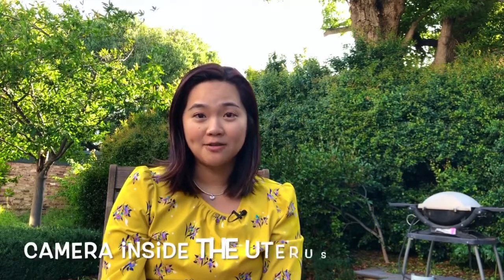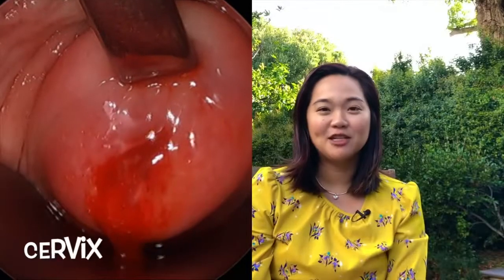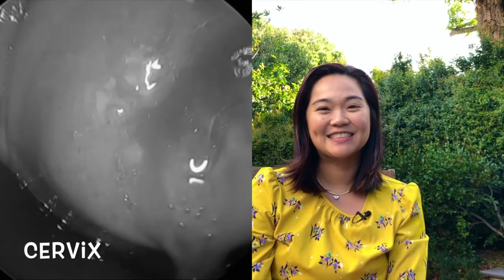Today, I'd like to take you through a hysteroscopy. It's a common gynecological procedure where we insert a camera into the uterus to have a look inside the uterus. So here's the operating theatre. It's just some bright lights. I'm turning the video to black and white in case you're squeamish about procedures.